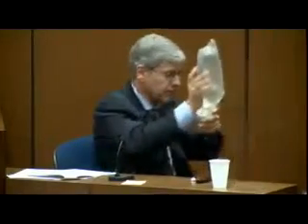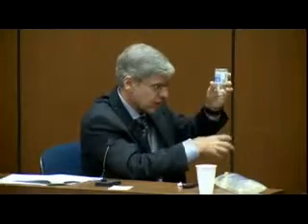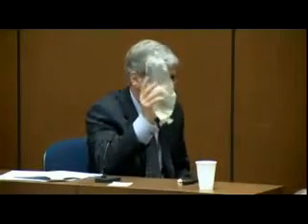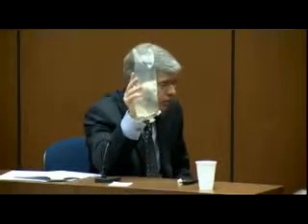You can either go through it with a small needle to draw a drug into a syringe, or as has been done in this case, one can go through it with a large spike, as I described for this. And you can remove it with an infusion as a drip. So a spike would go into this, and that would go to a drip chamber, and drug would drip out of this. The one key thing to point out, though, when the saline comes out of this bag, the bag just shrinks. It gets smaller. There's no problem.